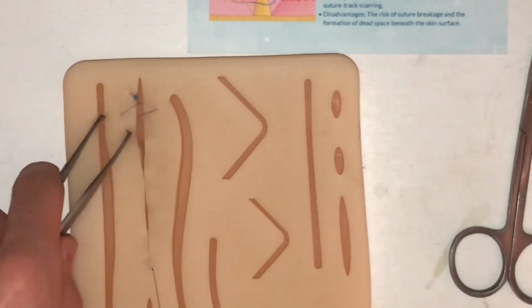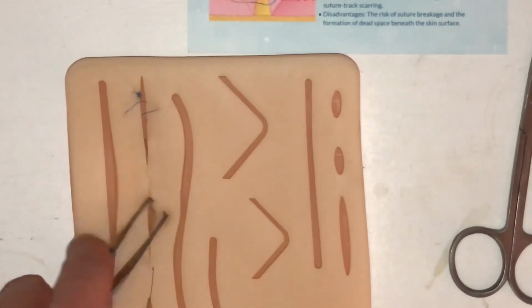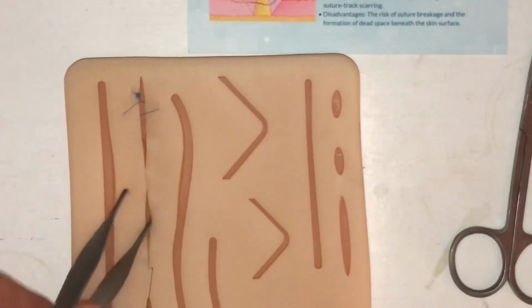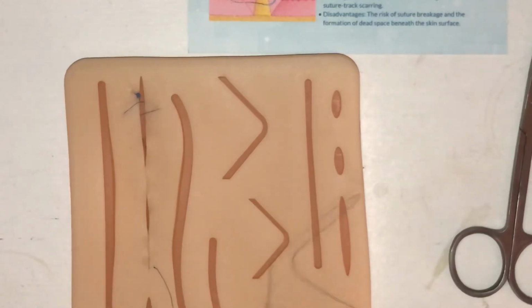The top is a little rough here because I didn't do my sutures close together, and then I have a little error here where I don't really know what happened. I guess I just did them too far apart again. But then at the end, it looks whatever. I don't know how she said to close, but we're just going to do some of the simple knots that we learned earlier, which obviously I shouldn't do because it's a needle. We're going to do them anyways.